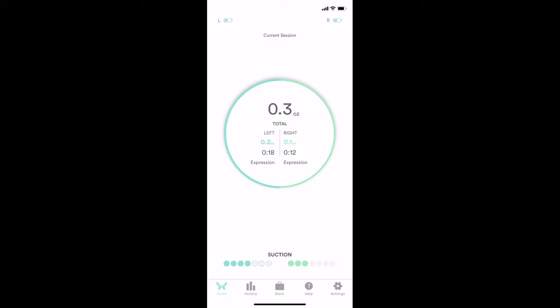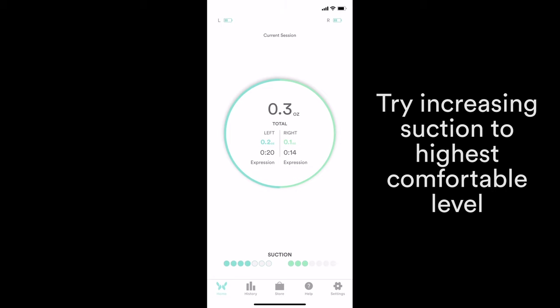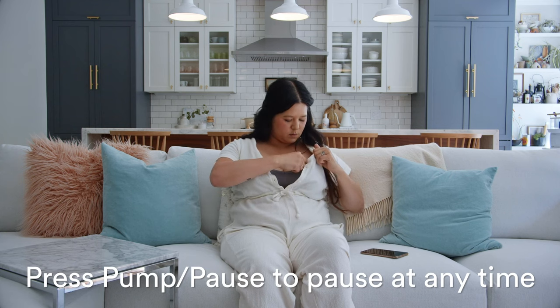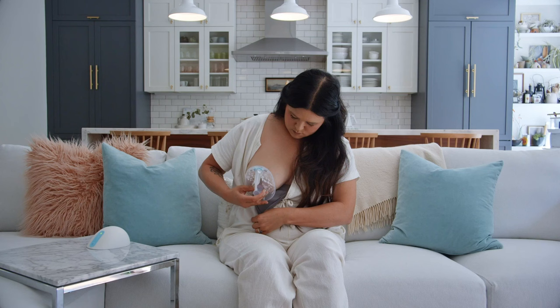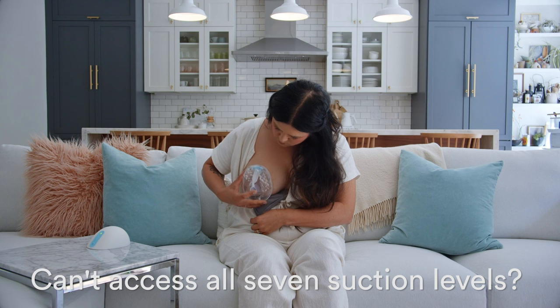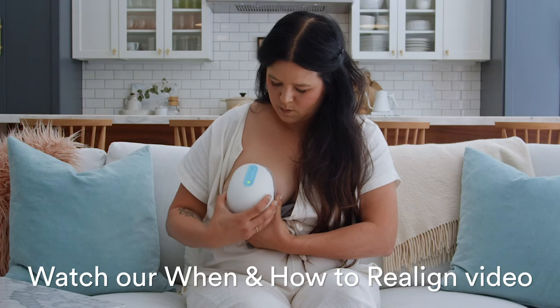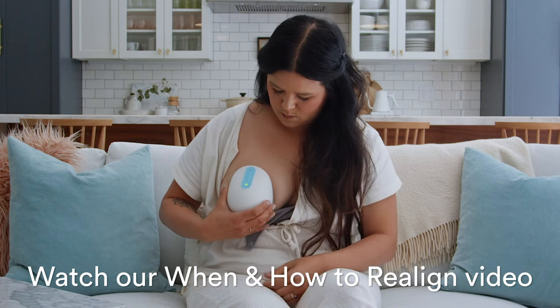Once you have access to all seven suction levels, try increasing to the highest level that's comfortable for you. If you want to pause your session at any point, press the pump pause button. If you're never able to access all seven suction levels, you might need to realign. Check out our realignment video in the app for more.